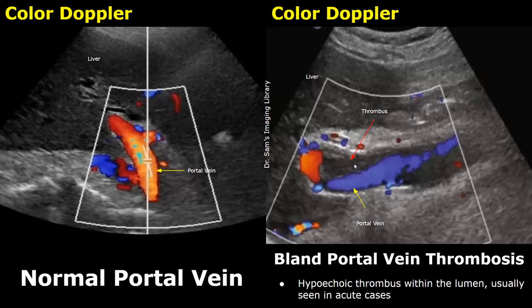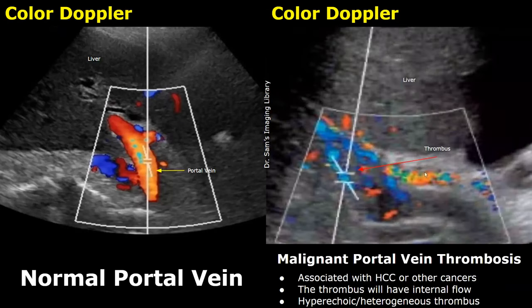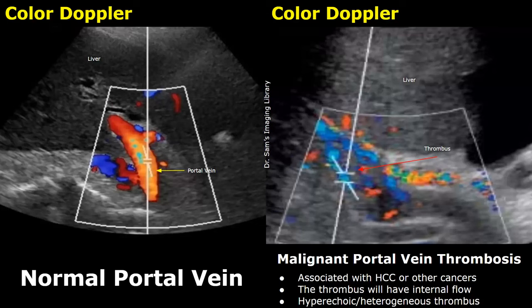This is the thrombus — it is hypoechoic and has occupied the lumen. No blood flow is seen within the thrombus. Malignant portal vein thrombosis is associated with liver cancers such as hepatocellular carcinoma. The main distinguishing feature between a malignant thrombosis and a bland thrombosis is that the malignant thrombus will have internal flow, which will be seen on color Doppler.